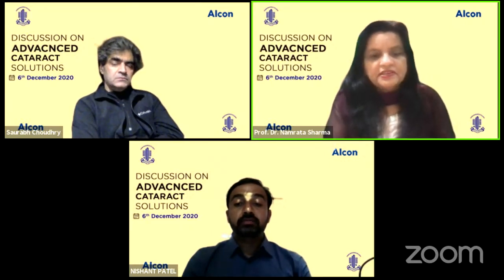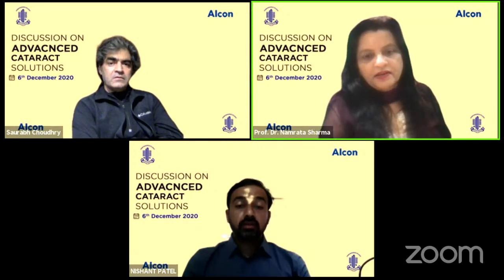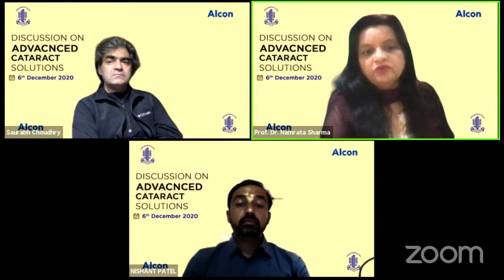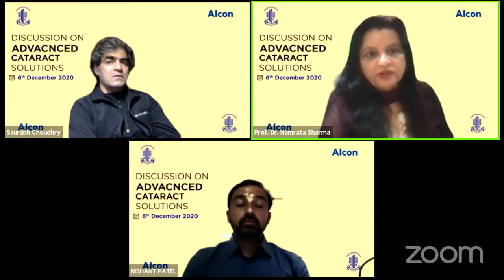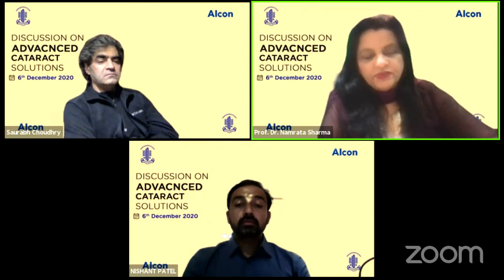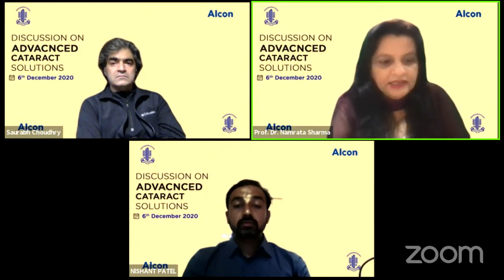So I think that message is very clear, Nishant, from what you said: if you have a pterygium, however insignificant it is, and you are planning a multifocal intraocular lens or a trifocal or a Panoptix lens, then it is important that you do the pterygium first and see how the astigmatism is. Of course, if there's an irregular astigmatism, then it's a no-no. But if it is not, then maybe you can take a call on that at a later date.